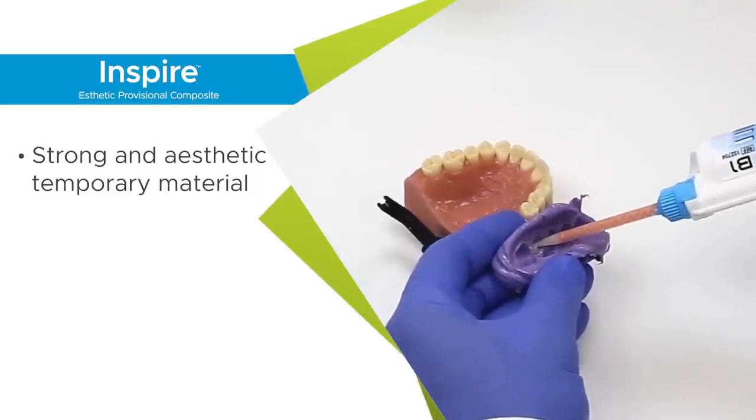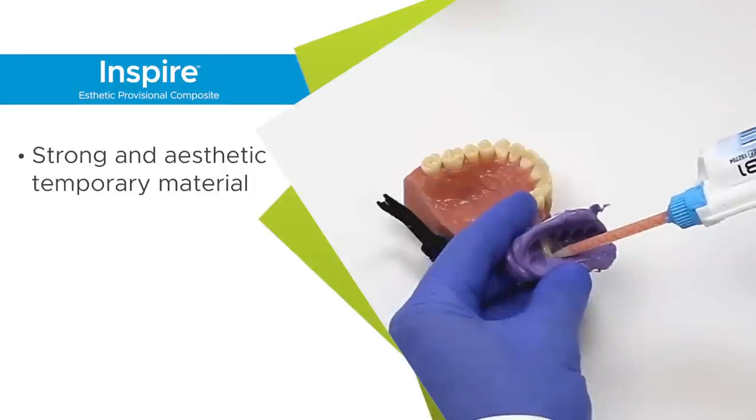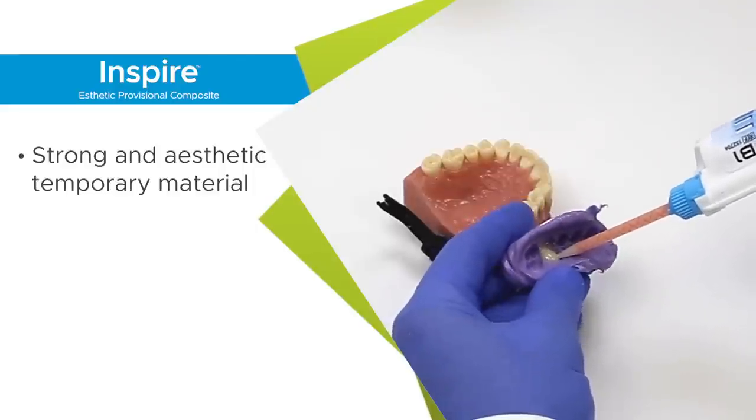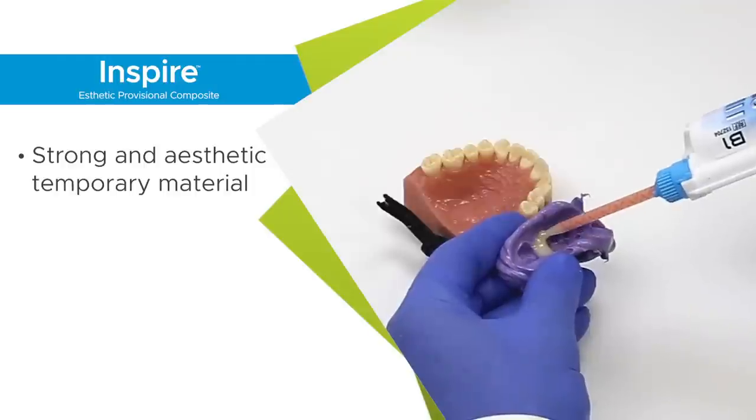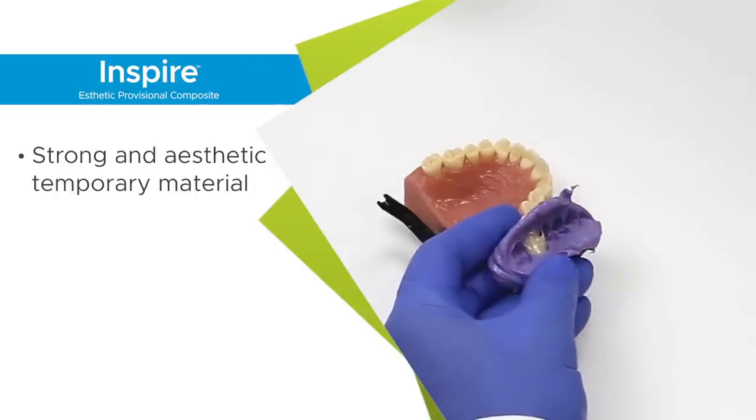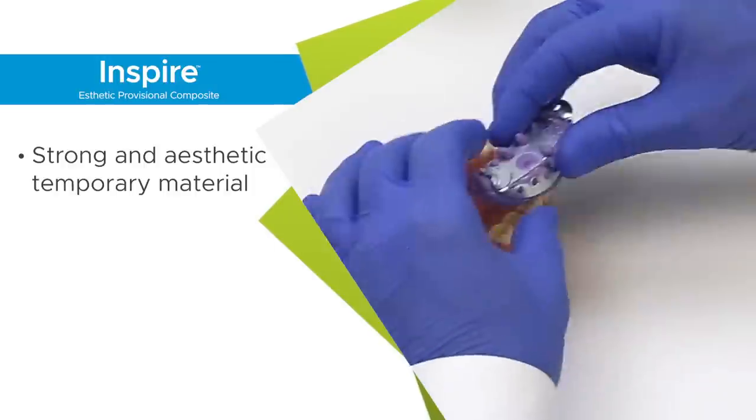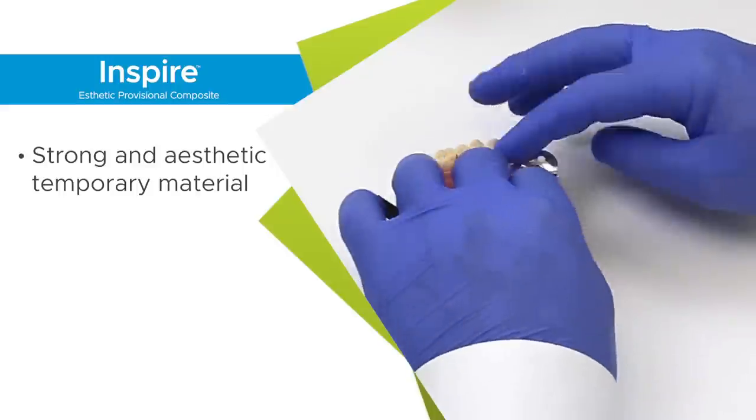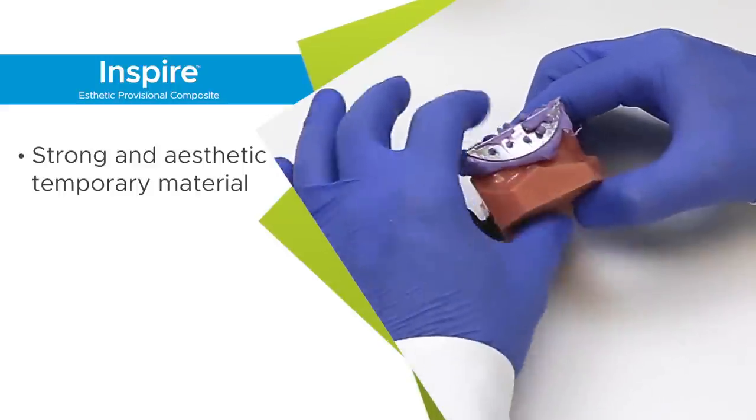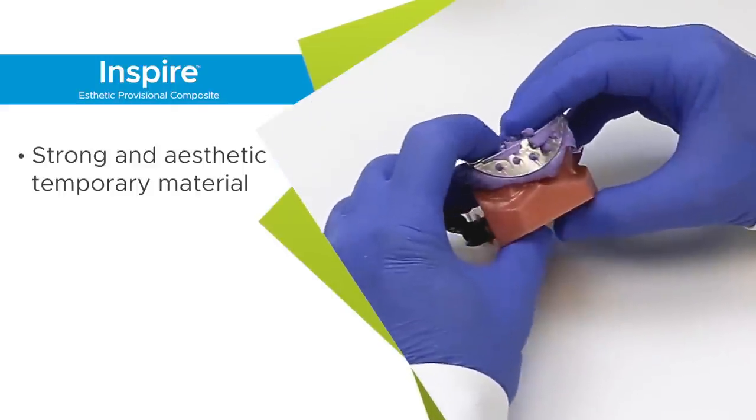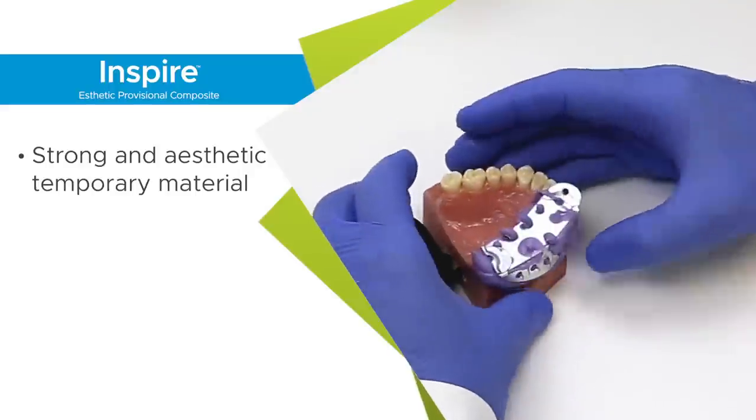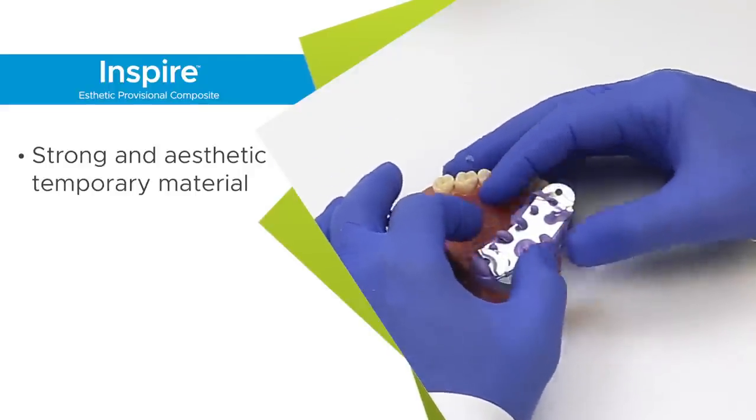We're just going to place this material into our matrix, always keeping the tip submerged. Turn it over and we're going to place it onto the prepared tooth. After about two and a half minutes, this will be ready to be removed.